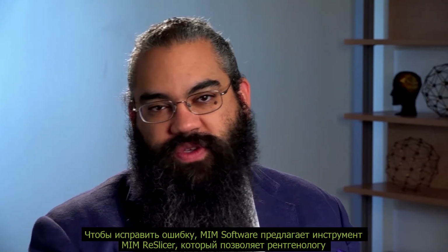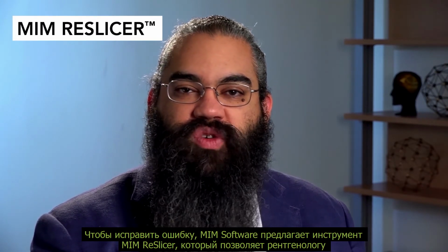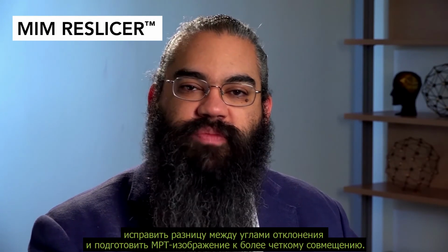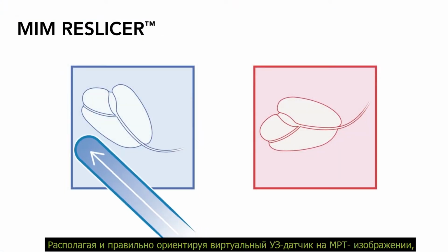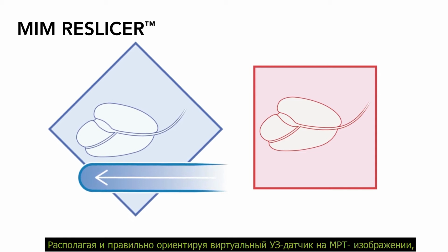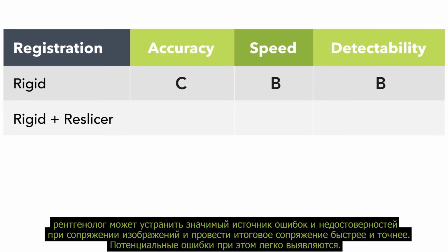To correct this source of error, MIM Software introduced the MIM Reslicer, a tool which allows the radiologist to correct this orientation difference and to prepare the MRI for a more accurate fusion. By simply positioning and orienting a virtual probe over the MRI image, the radiologist can remove the greatest source of registration error and uncertainty, making the final registration faster, more accurate, and leaving potential errors more detectable.